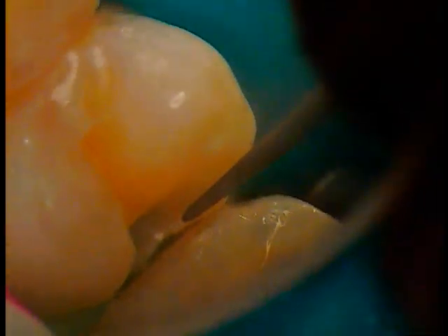Now someone also asked me about, you know, when do you put the Vitrebond in place? You put it in now. You don't put it in after the bonding layer. You put it up against the tooth. You want it to work on the tooth, not on a resin layer. Right? So do it. Do it right.